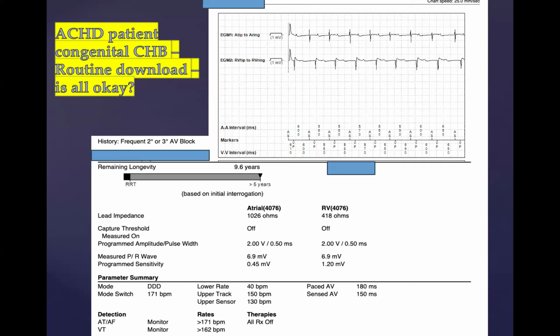I should also mention that technology to assess the threshold beat to beat has not been established to be effective or safe with epicardial leads, and I am even a co-author on a case report where we showed a case where if we had turned on capture management, the patient would have not been paced or lost capture because of improper measurements for epicardial leads.